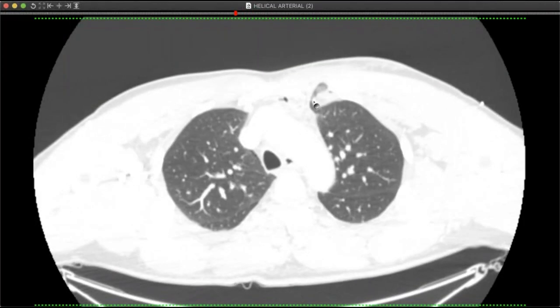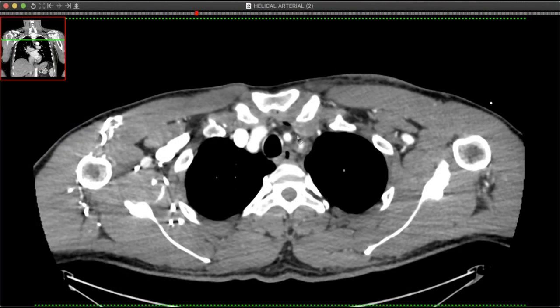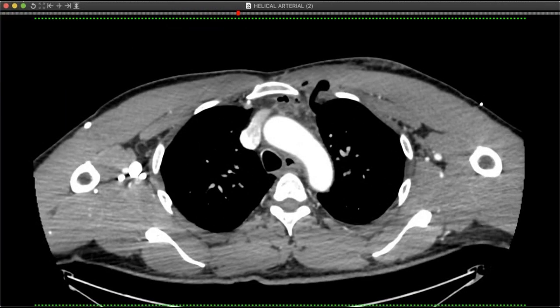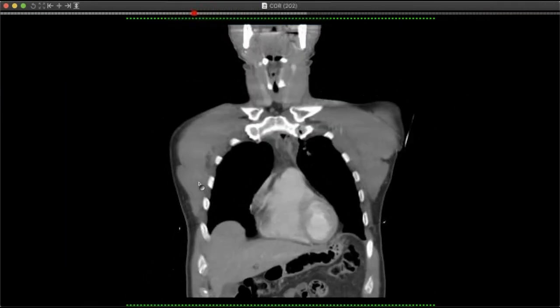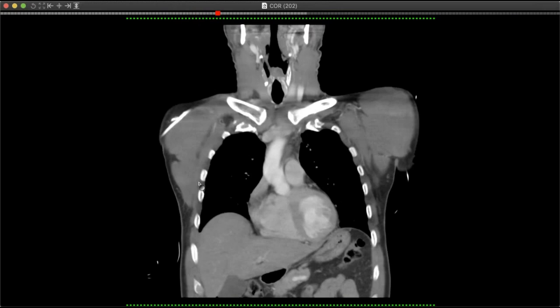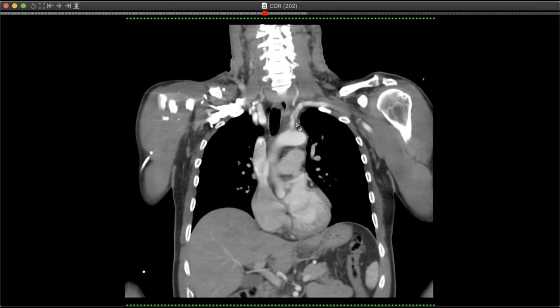Yeah. So I like Travis's theory that the sternoclavicular joint, I mean, right in here, it's got a big hematoma in it. Yeah, and just hit that. Wow. So if that is the case, it's kind of the osseous pinch theory of aortic mural injury in general. It could be like a variant of that theme. Maybe. Yeah, you can see it right there, the abnormality. Squash the artery. Wow. All right. This is the Klingon nerve pinch variant of that.